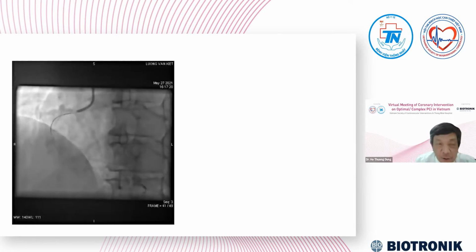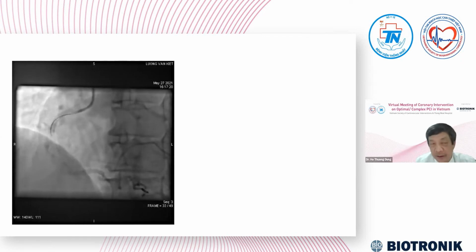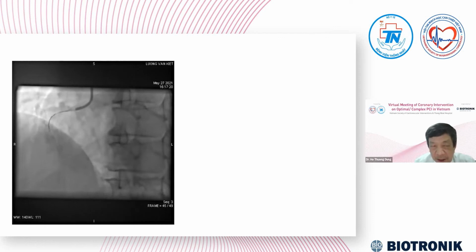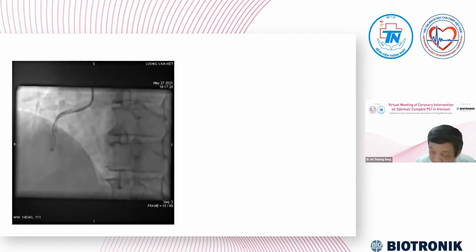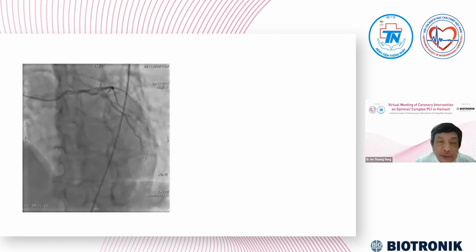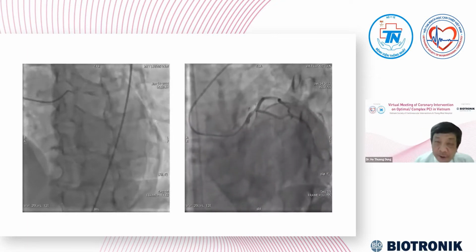And this is the result. So I think the proximal segment and the mid segment of the RCA is okay, but the mid and the second curve is still severe. The patient still has chest pain. And the patient was referred to our hospital.